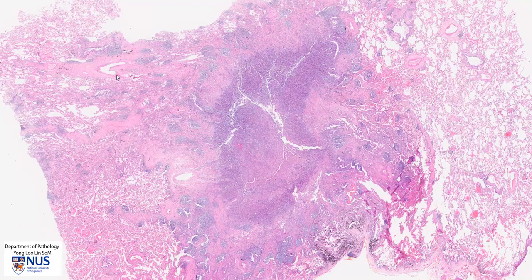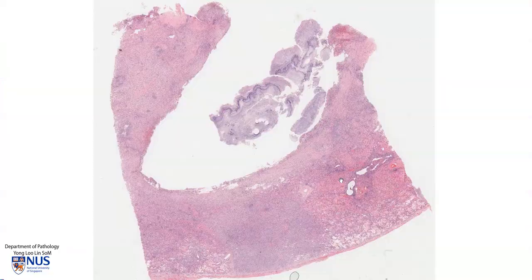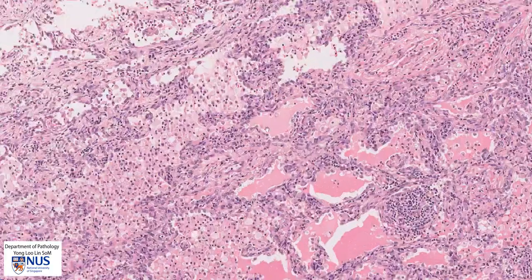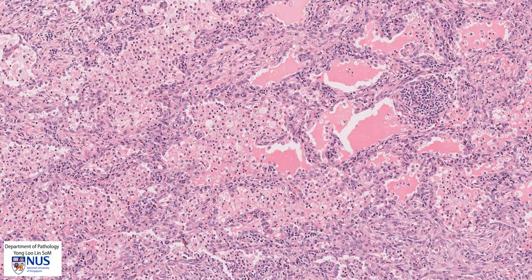Here is another example of an abscess, and this is the lung parenchyma. In this instance, there is a lot of consolidation around the abscess cavity. Zooming into the lung parenchyma, we see there is a lot of fluid and exudate within the airspaces, and also lots of macrophages.